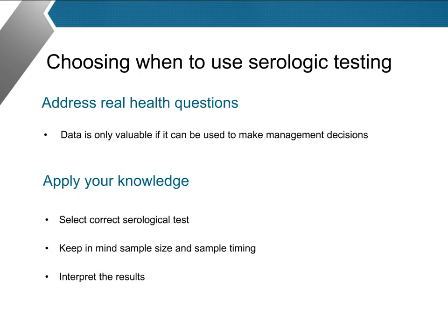So next we'll discuss choosing when to use serologic testing. You want to address real health questions and apply your knowledge by selecting the correct serologic test, considering sample size, timing, and interpreting the results correctly, and we'll go over each of these points.